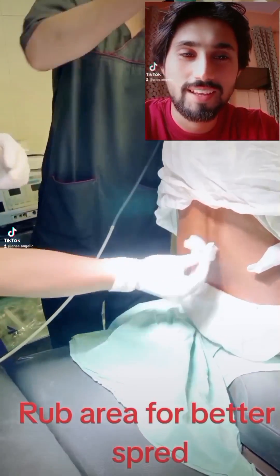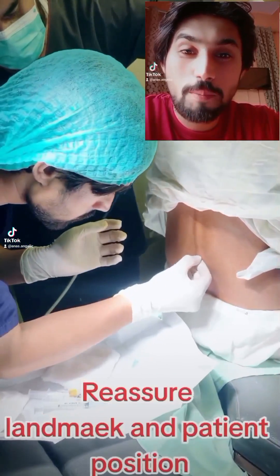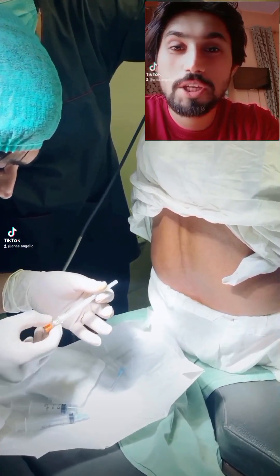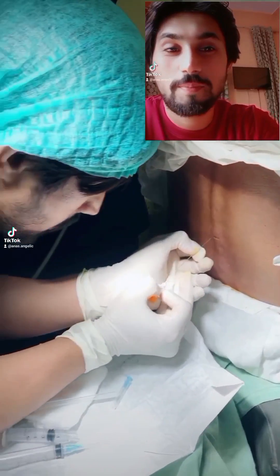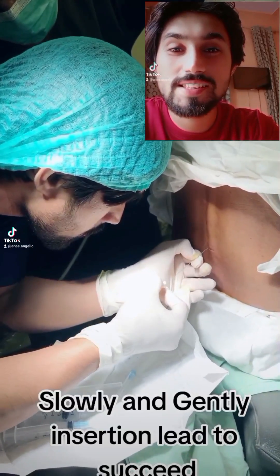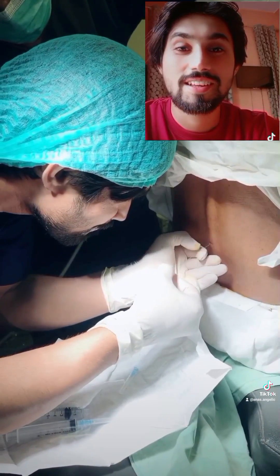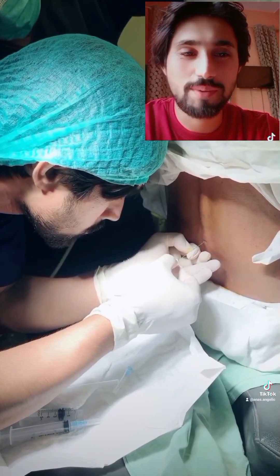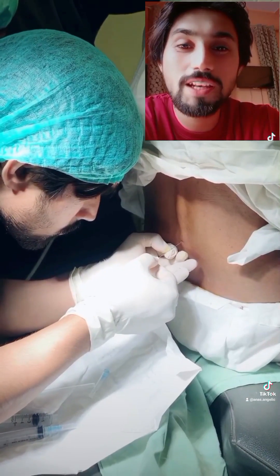With proper aseptic technique, reassure the patient, confirm position and landmarks, and gently and slowly insert the spinal needle. This may lead to successful needle placement in the subarachnoid space. When you feel the pop, you should proceed to the next step.